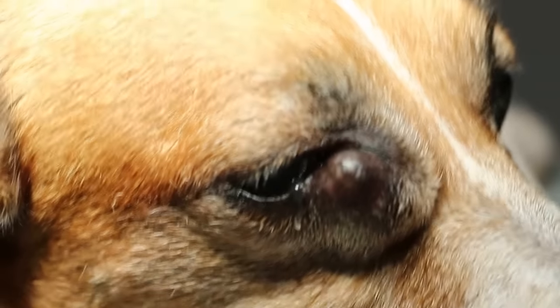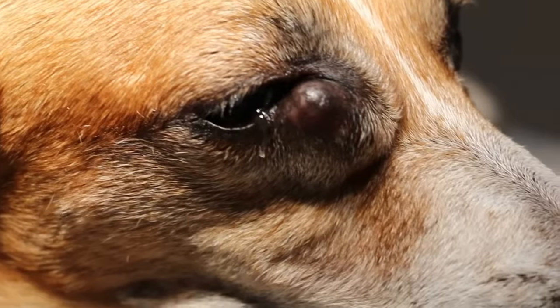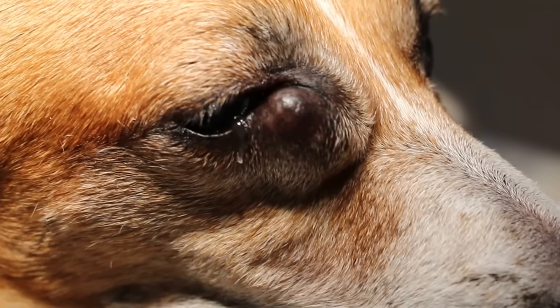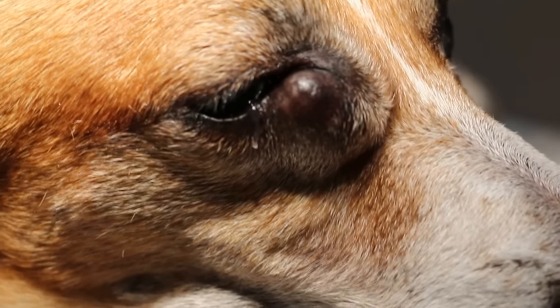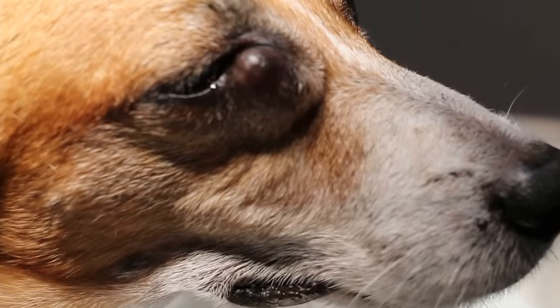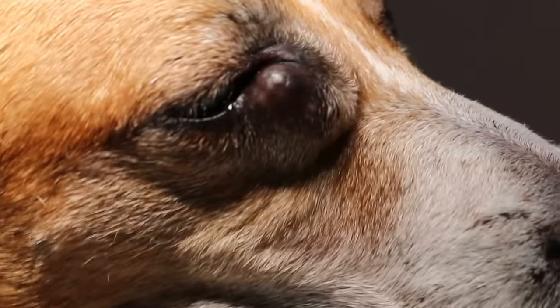The dog is sedated. We get a needle and check for abscess. What we do is take the bigger needle — the green one — and see whether any pus comes out. If it's pus, then we know that it's an abscess. We just press it below a bit, using a syringe — a 1ml syringe or something — to see whether it's an abscess or whether it's very hard.